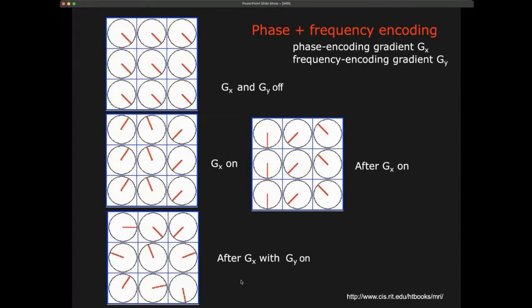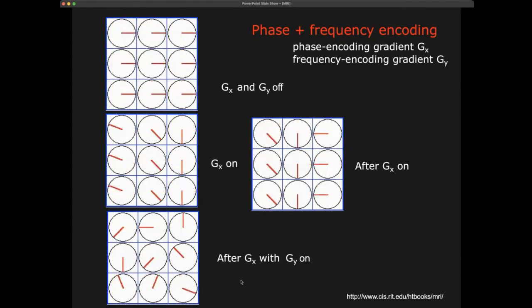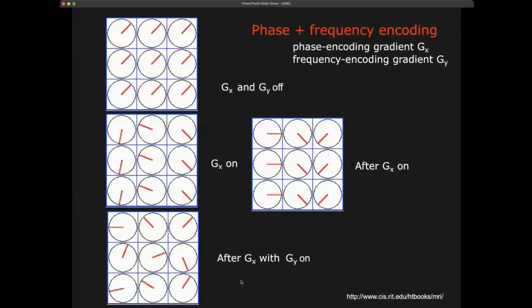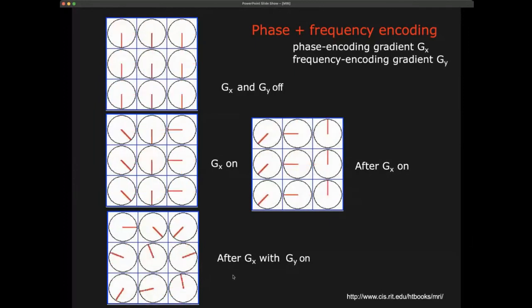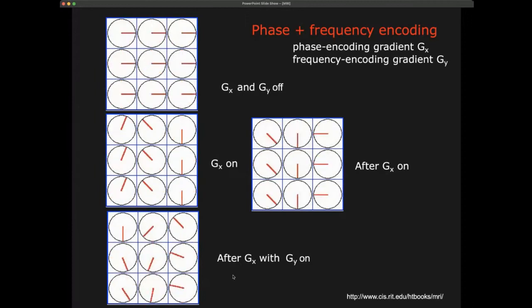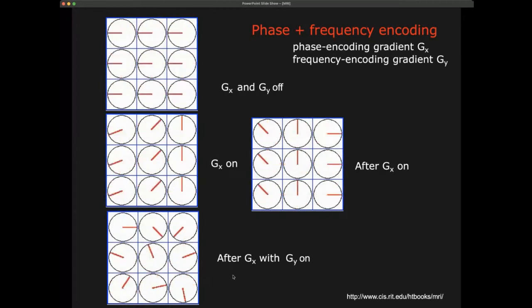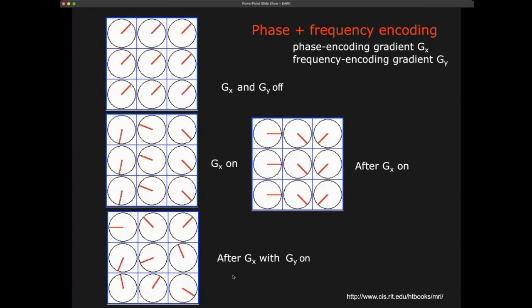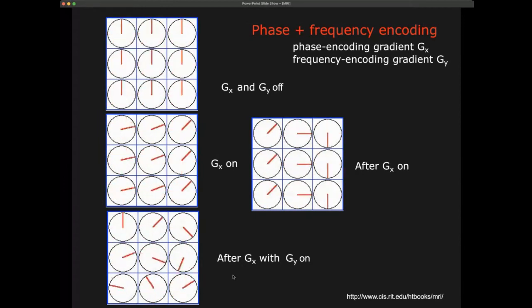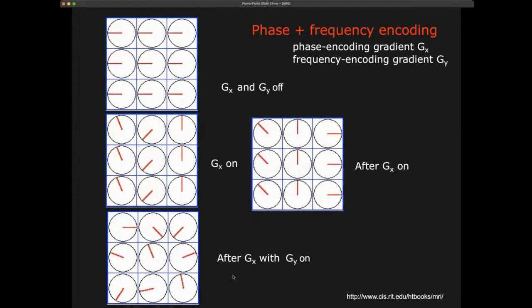Well, because we don't dephase them so much. And the thing is, what you will see is, of course, you can only do a bulk measurement, and that's what we will see next. What we actually do is we measure by first dephasing a little bit, then dephasing a little bit more, then dephasing slightly more. So in that sense, you are right that what you measure is the sum of all this. So in the Y direction frequencies, we can measure all frequencies at the same time. But the phases we cannot measure at the same time.